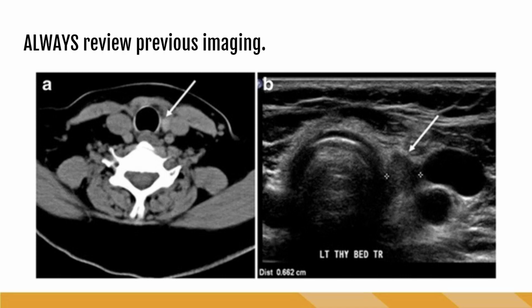Since ultrasound is basically the gold standard for evaluating thyroid tissue, it is very, very common for us to get orders to look at thyroid nodules incidentally seen on other imaging. So always review previous imaging for any thyroid exam you have on your schedule. Another big thing that we use ultrasound for is to follow up other ultrasounds. Thyroids tend to be imaged every 6 months, every year, especially if we have nodules that are in the gray area for their suspiciousness. I always print off the previous worksheets to use them as a roadmap in complex thyroid cases.